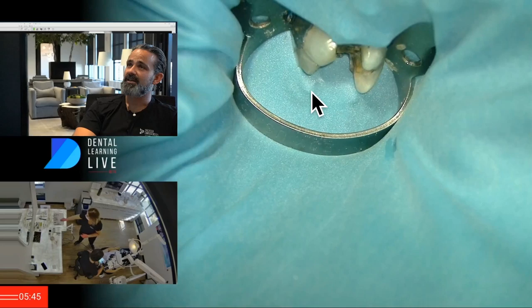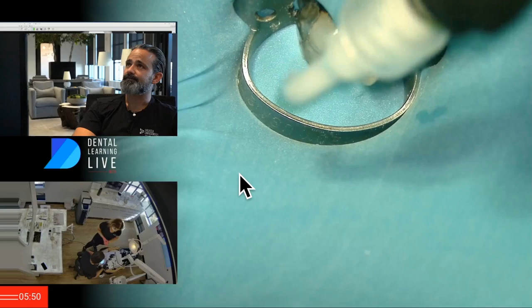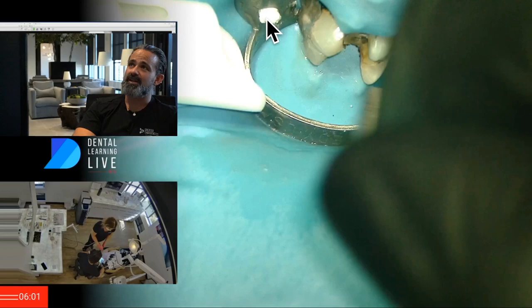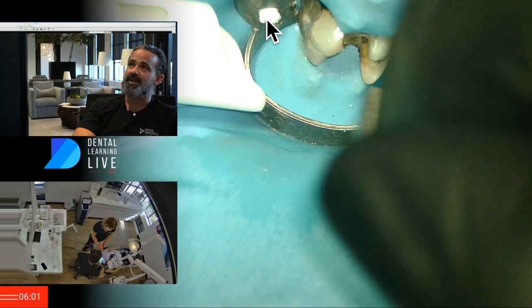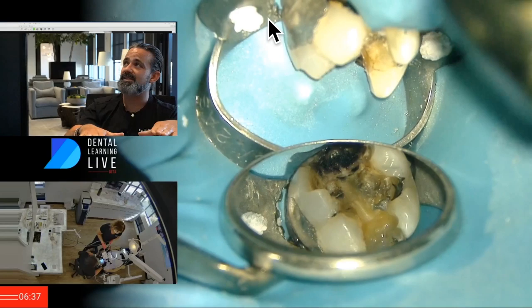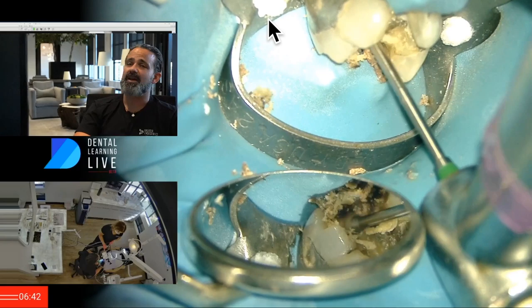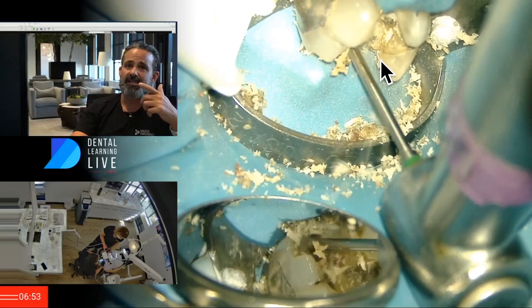Now that I've got the rubber dam seated underneath the contacts, I'm going to remove the decay in that distal box. I get asked all the time why I always use the putty when it seems like extra work. When you inject the putty into the forcep holes, it actually pushes a little positive pressure on the rubber dam and creates a seal underneath the clamp — it just settles the rubber dam down ever so slightly, so when I'm removing decay I don't catch it with my bur as easily.